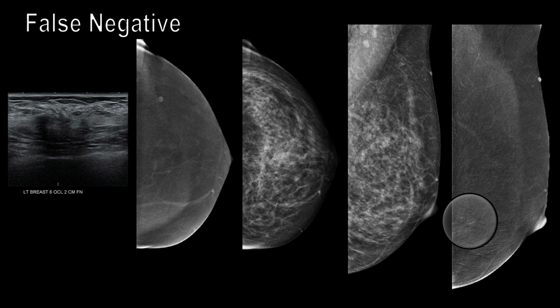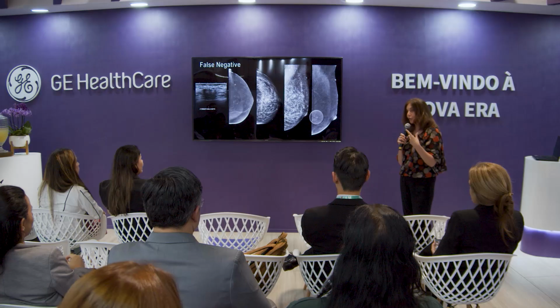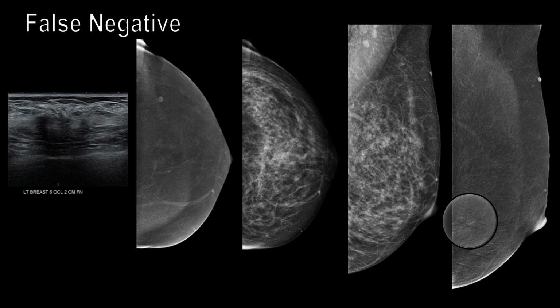Now, but that's the thing with contrast-enhanced mammography. Sometimes, if we see a very subtle abnormality on the lower energy view or a change from previous, we can appreciate that there is a very little enhancement that we otherwise wouldn't appreciate. This can be much more difficult with MRI because we don't have a prior exam for comparison. So there is a strength that comes with the availability of prior imaging.